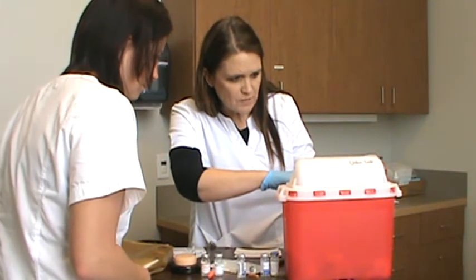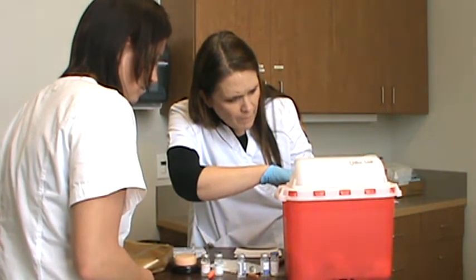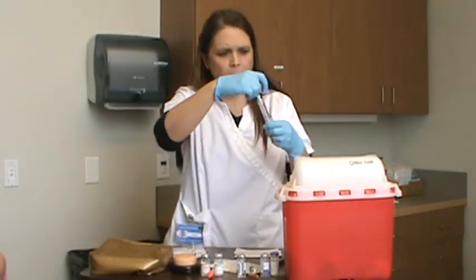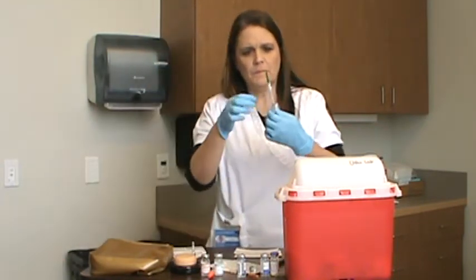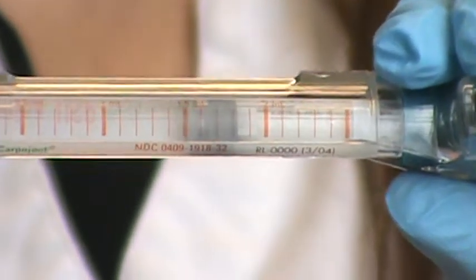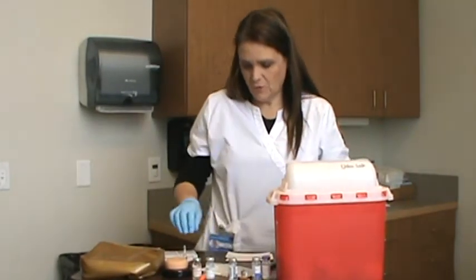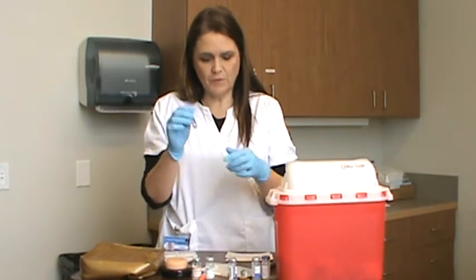Try not to squirt my patient or you. Okay. Yes, I can see it's at 1.5. Okay. At 1.5. So then I could go ahead and give that. I'm going to use this ampule to give my morphine.